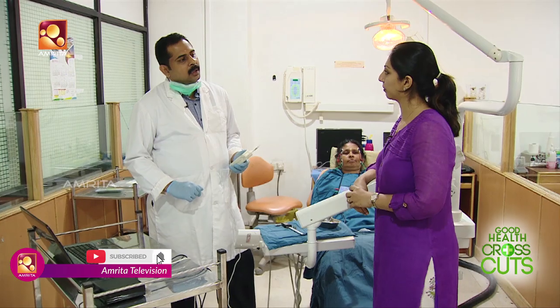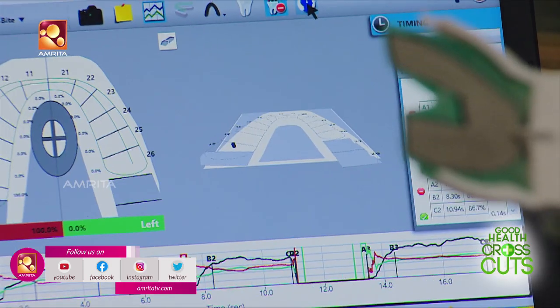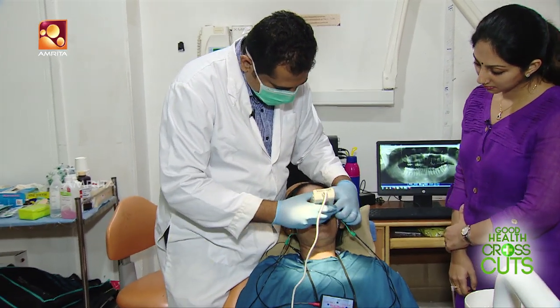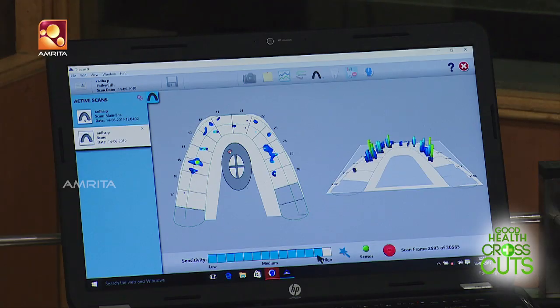On the monitor, we have T-scan data. It will be marked in a U-shape. If the patient bites, there will be pressure points shown. This equipment also has timing — we are able to capture the action in milliseconds and pick up very fine data.